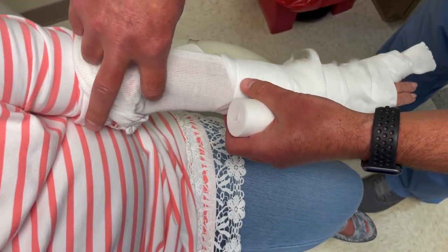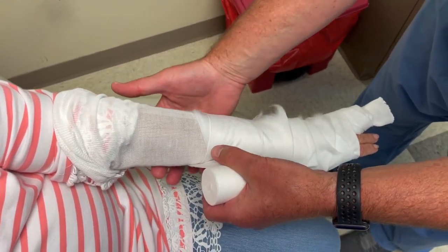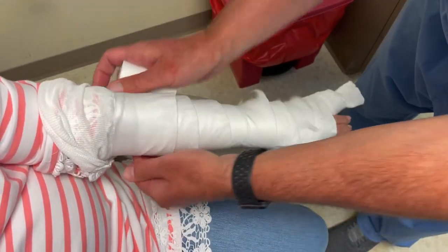Here's the antecubital crease right here. You want to wrap up to that with the web roll, and then your splint is gonna go short of that — the splint is only gonna go to about here. But you're gonna take your web roll all the way up to the crease. So I would wrap her about up to there.